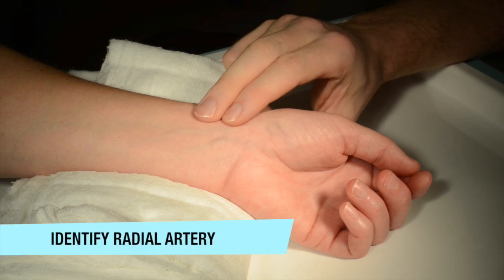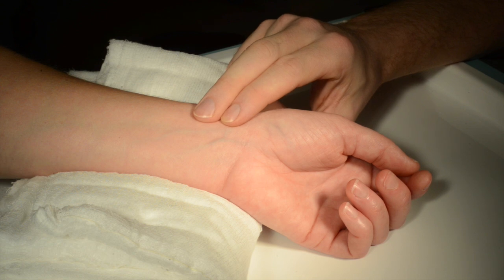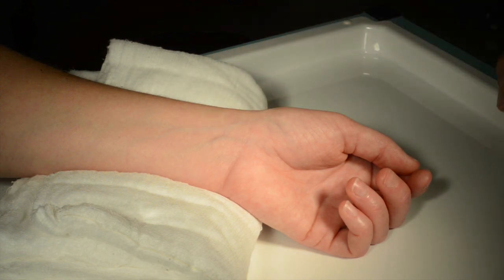Palpate the radial artery. Use two fingers as shown to find the maximum point of pulsation.